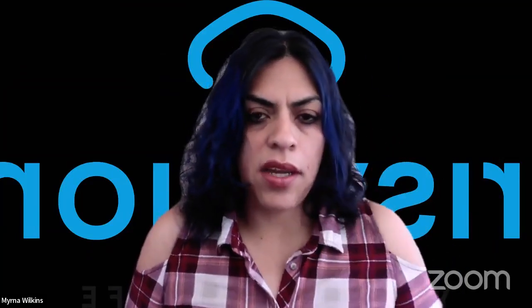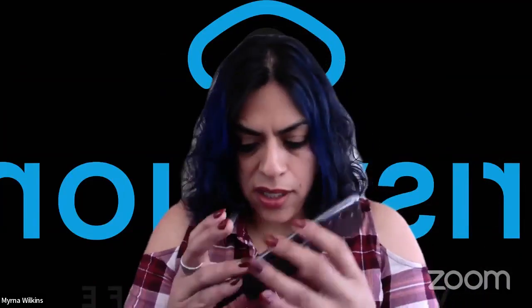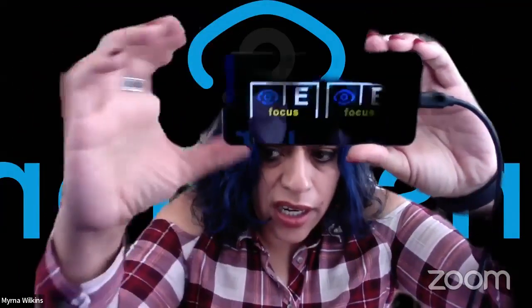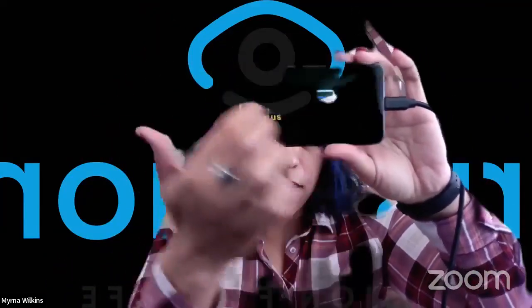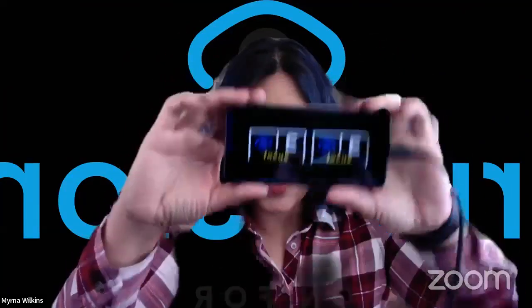When you plug the phone in, you should see inside of the headset a focus screen. It's going to have a big blue eyeball on the left, a white E on the right, and the yellow word 'focus' at the bottom. If you're able to see this — there's a bit of a glare — it's not going to look double like this when you're wearing the headset. That's how it's going to look inside of the headset.